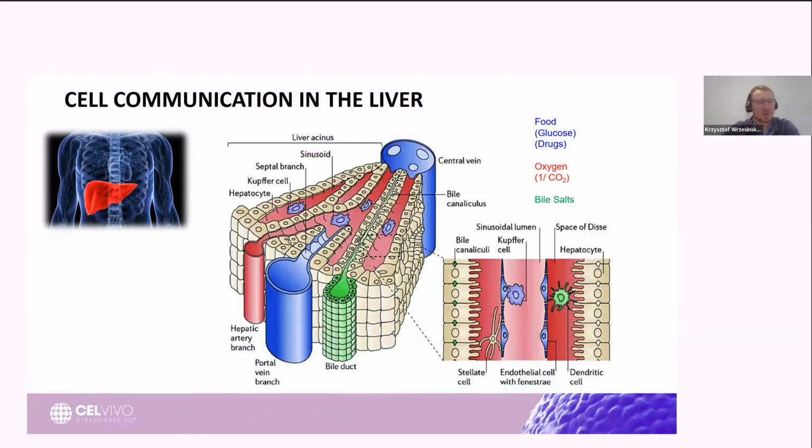Let's start with this: in our laboratories, we create models to mimic in vivo organism behavior. Most often it is the human body we are trying to mimic. To be specific, quite often we are not going for the whole body, but we are trying to mimic a part of it. So an organ or tissue is our modeling target.